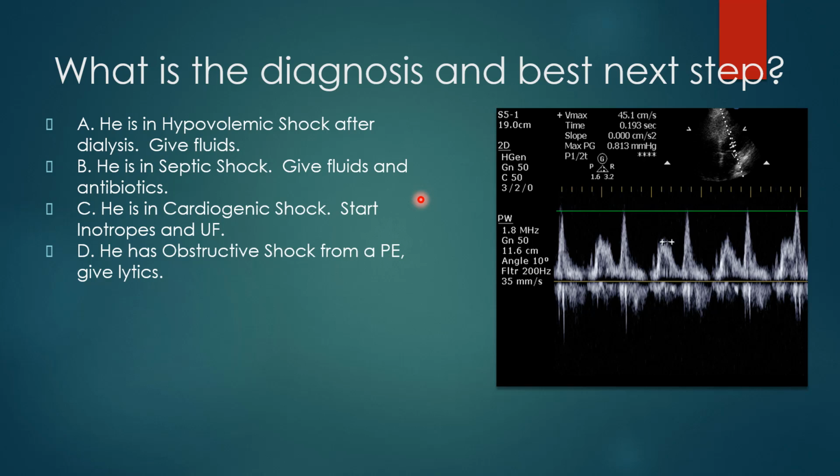All right, well, what about this? Let's take the exact same case, but my E is much smaller, 45 compared to 150 before. My E is smaller than my A. Now, if I was going through the same reasoning, again, this is simplistic. It's a reductionist kind of approach, but again, you have to think about this. This is one data point in the whole picture. Now, if I had this picture, I would say that this is probably less likely because usually in left ventricular cardiogenic shock, you're going to have elevated left atrial filling pressure. So this is probably unlikely.